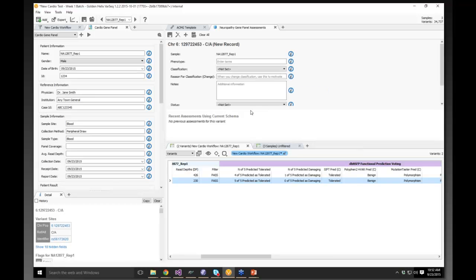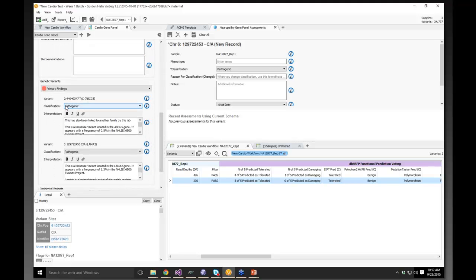So here's a gene panel database, and this is very customizable. We touched on this in a previous webinar if you want to look at that. This information, including the classifications that you may set on this variant, can be pulled into reports. So that lab-specific classification can be automatically filled in, and it can actually change the default value here.